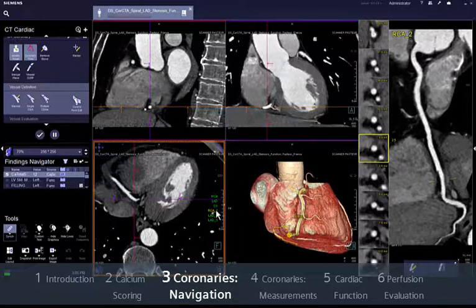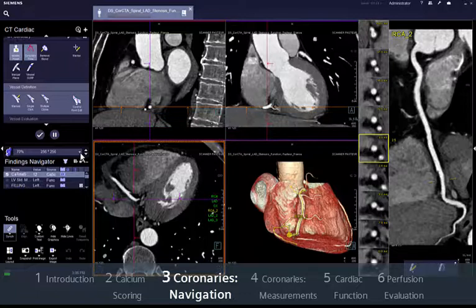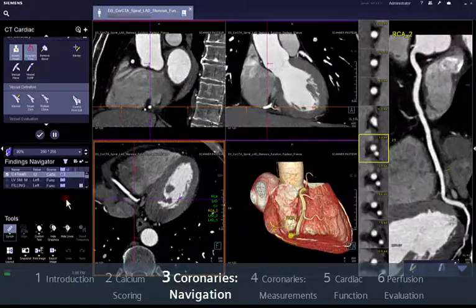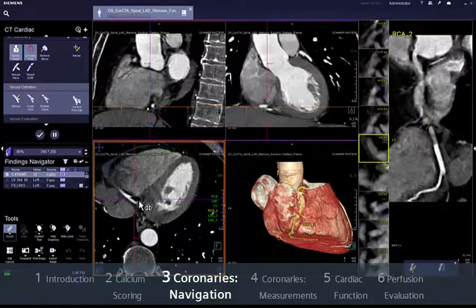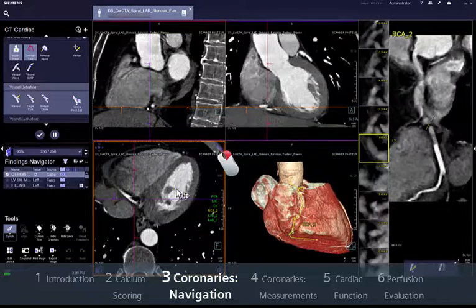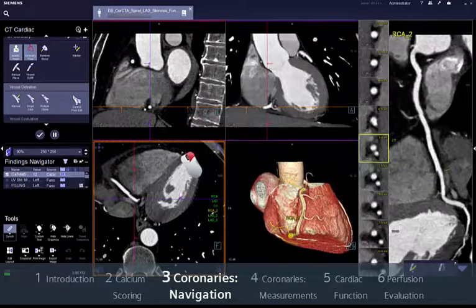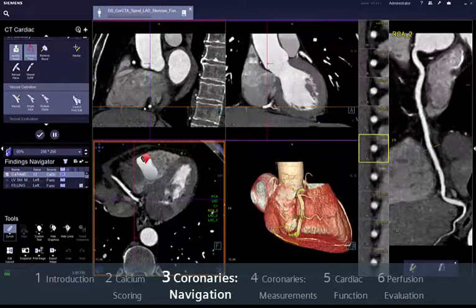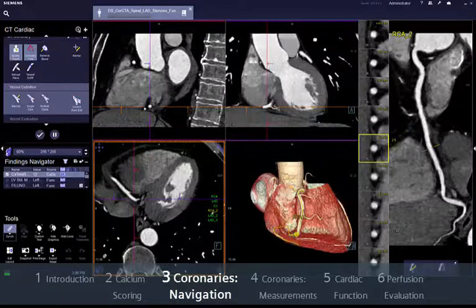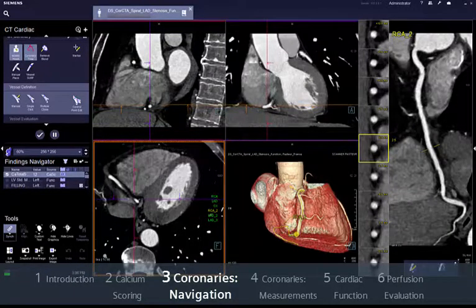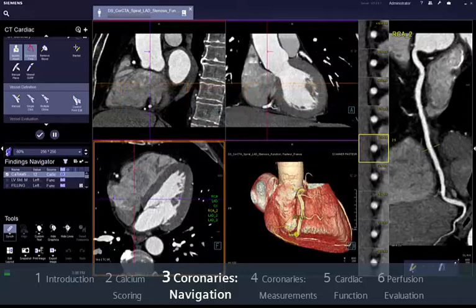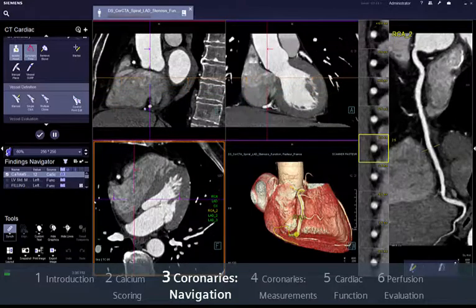In the case of a multi-phase study, the remaining phases have also been pre-processed in the background so you can easily check the individual phases by selecting them from the drop-down menu or, more conveniently, by right-clicking and dragging the mouse horizontally over the NPR segments. This will help you find the series with the least motion for the different coronaries, which is especially useful for reading challenging cases.